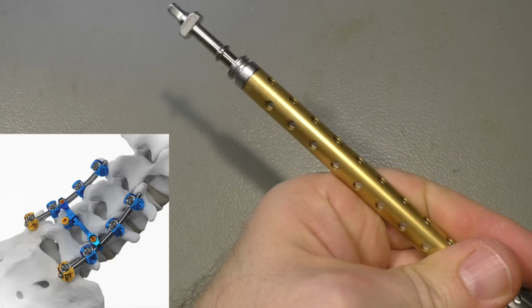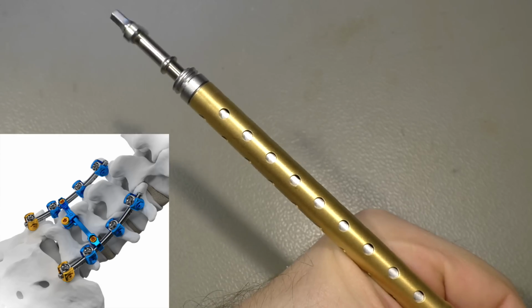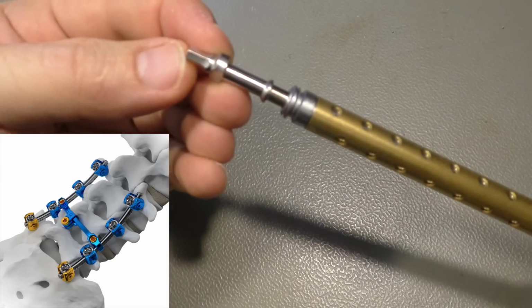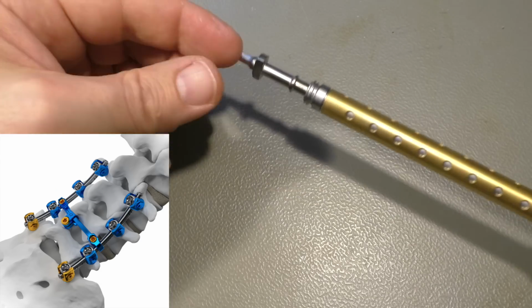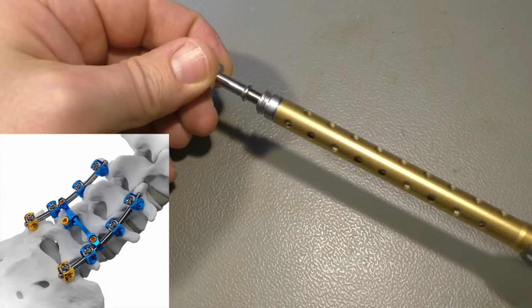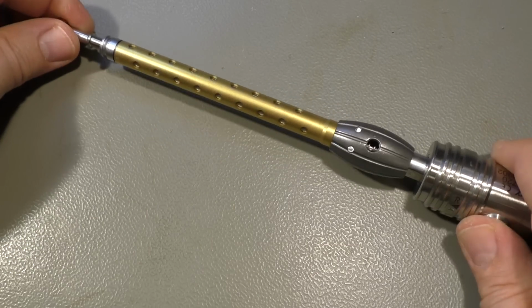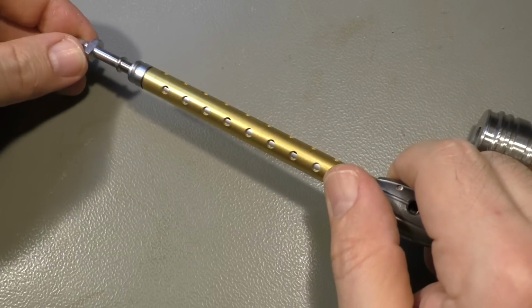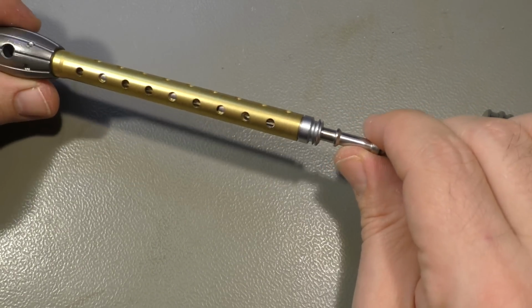And then, of course, there is the ratchet, which has the same hex drive here with an additional shape here. So this grips into that special screw and drives it into the bone, into our pre-drilled, pre-tapped hole. But it would be interesting to see what kind of screws are used here. I have seen a picture of them. Maybe I can show you that.